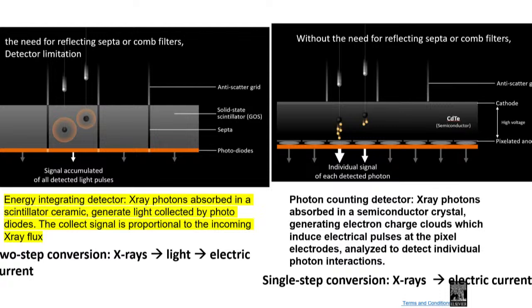So basically, you can consider this is the middle step, right? Versus photon counting CT, okay? This is a type of different material using electronic pixels. It directly converts into an electrical signal, so you don't have to go through an extra step.